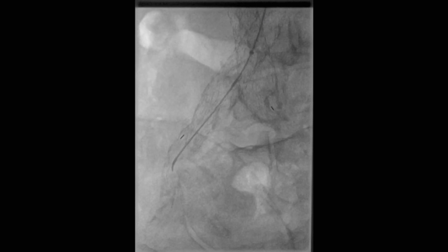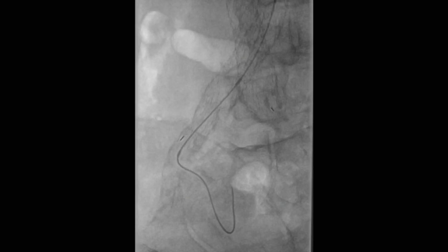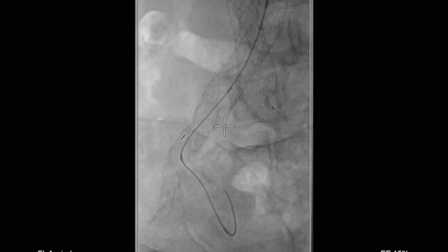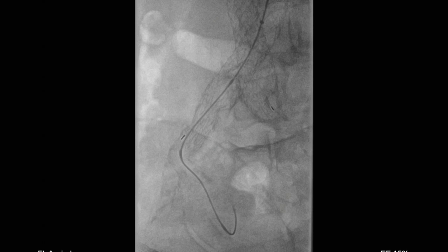Catheterization of this was actually fairly easy. The important principles of embolization are: you want to have your diagnostic catheter well seated into the aneurysm and ideally the sheath very close to the take-off of the internal iliac. You can see the wires actually retroflexing inside that aneurysm. Here we're using a quick cross catheter, and we changed out and put a stiff glide wire in before we start the embolization process. We're advancing the sheath down so we want that sheath as close as possible to the aneurysm.